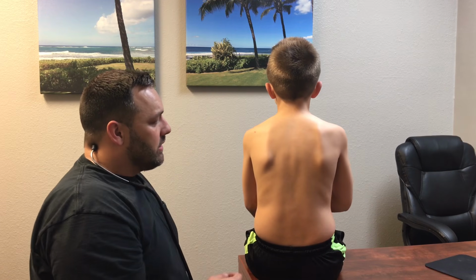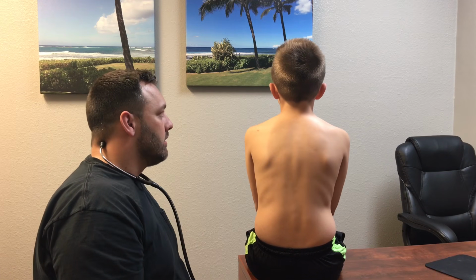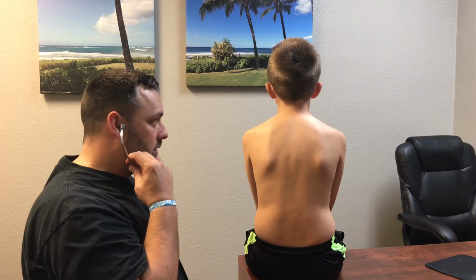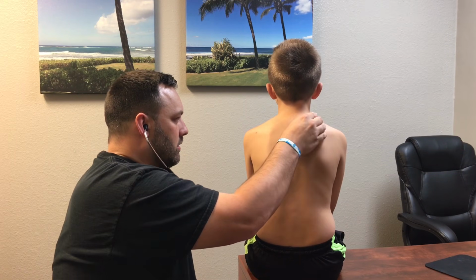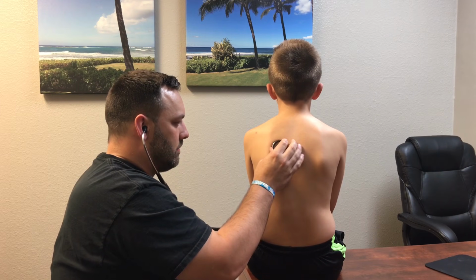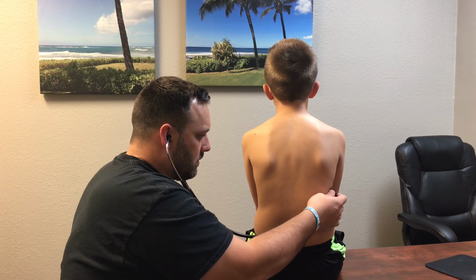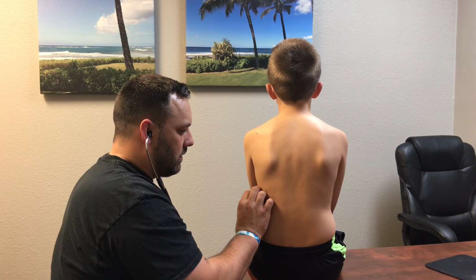Okay, so let's do the bronchophony as well. This is going to be the 99. Every time I place the stethoscope to your chest or your back, say 99. 99, 99, 99, 99.